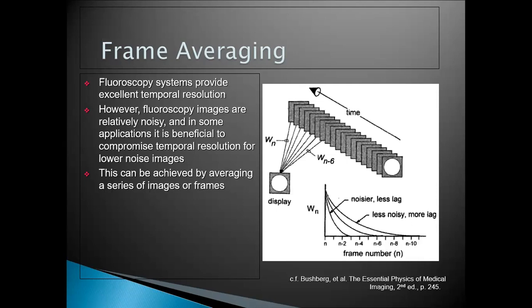But at the end of the day, we are going to have a kind of lag, because this information is just an average of all the information here. So the information here will be superimposed on this, assuming you have an object moving in a particular vessel.